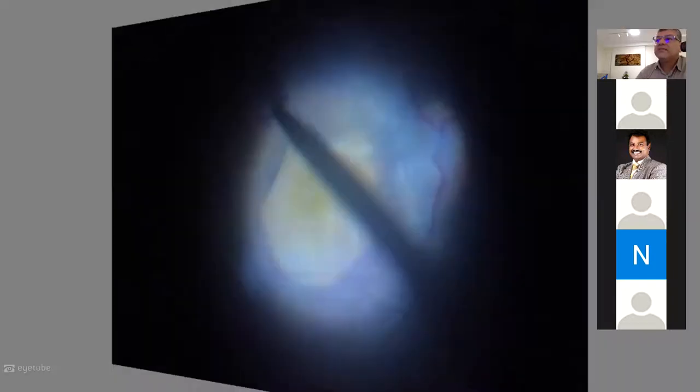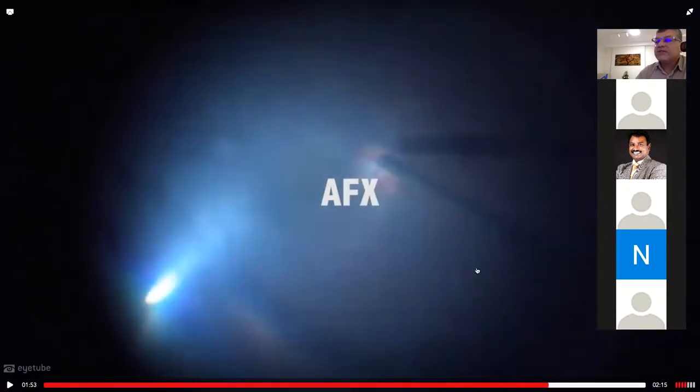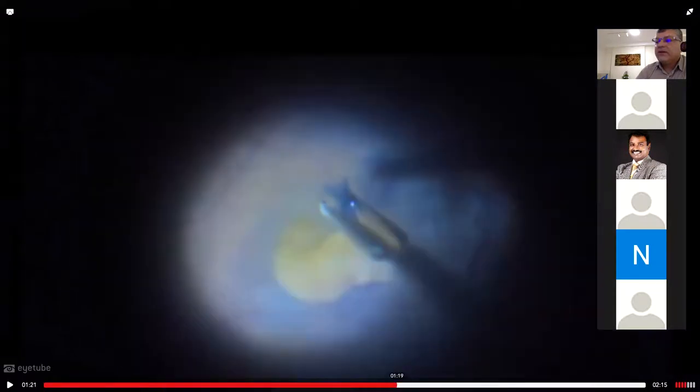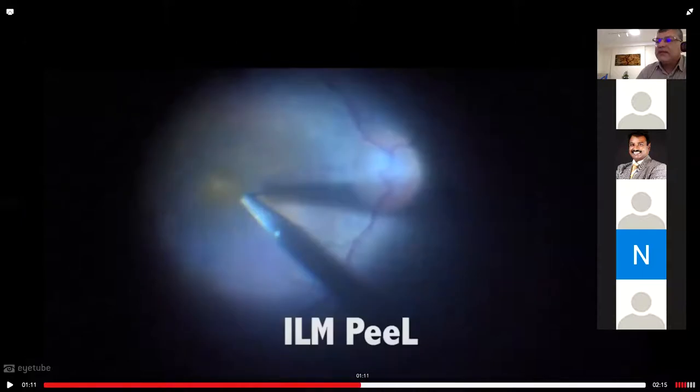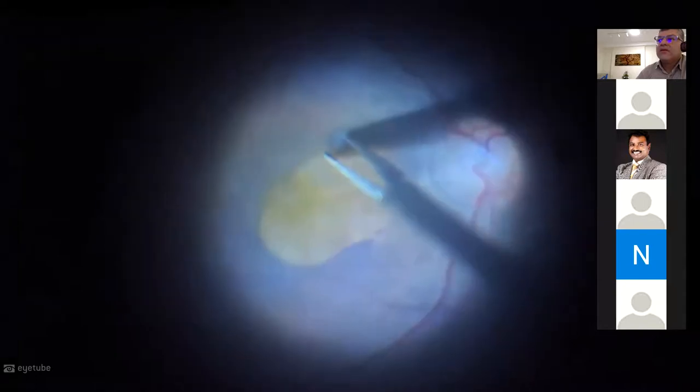It's easier now to unfold. It was easier to remove the membrane because I switched directions the other way around. When I first got the membrane and did the peel, it did not go in the direction I wanted — the edges of the membrane. So I switched direction the other way around — clockwise — then changed back from clockwise to counterclockwise and vice versa. Then I still grab the edges of the ILM. We keep going, relieving traction and completing the 360-degree peel.